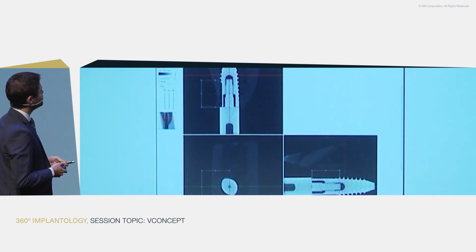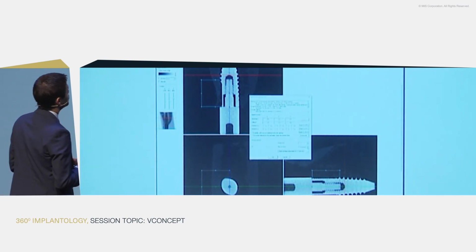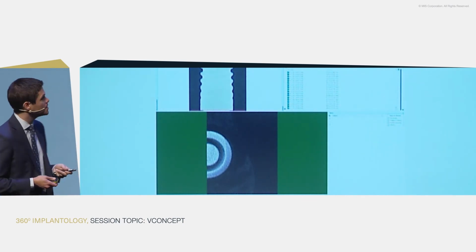So you can see here the type of area that we select, and once we lock that, we can go ahead and analyze the 3D reconstructions, and you'll see here in the 3D image how now we have a smaller section, as you can appreciate here. That's the buccal aspect and half of the implant that we are evaluating, and please appreciate that we are as well selecting part of the mesial and distal aspect of these implants.